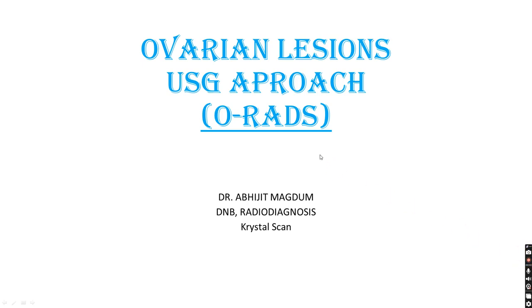Hello everyone. Today we will discuss the ovarian adnexal reporting data system created by the American College of Radiology. I request you to watch the previous video on ovarian cystic lesion USG approach before watching this video.